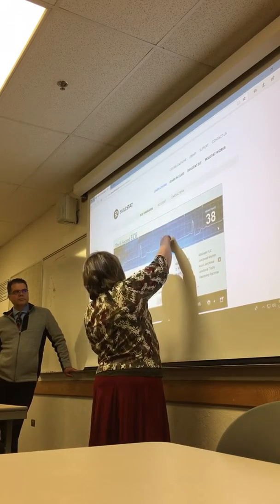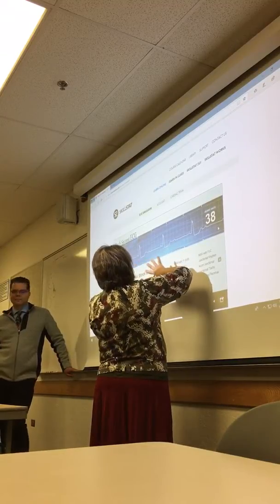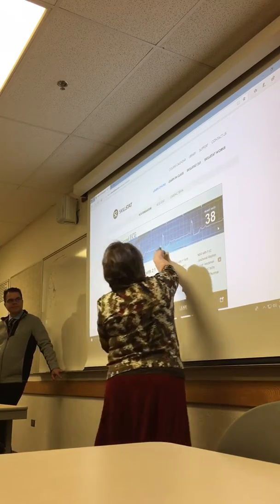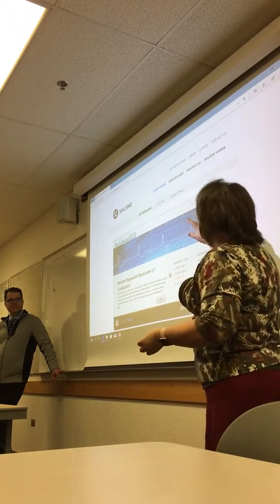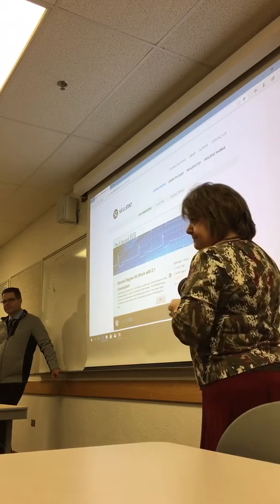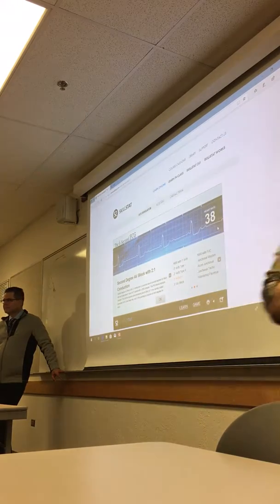Again, it's bifurcated, so it should come down here, and the ST segment depression doesn't mean anything for a second degree block, so that's why I don't like this one. But again, you've got a P wave, QRS, P wave, nothing. P wave, QRS, P wave, nothing. So it's a second degree block because we have a P wave with no QRS, but it's a 2-to-1 because every other one's doing it. We had a patient, is your patient a 2-to-1 the other day?